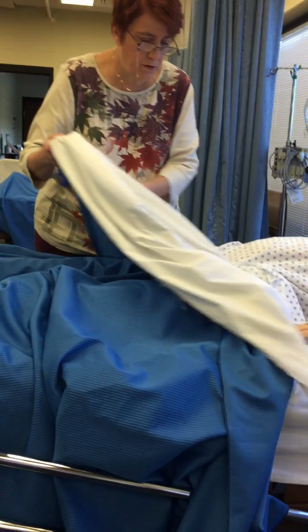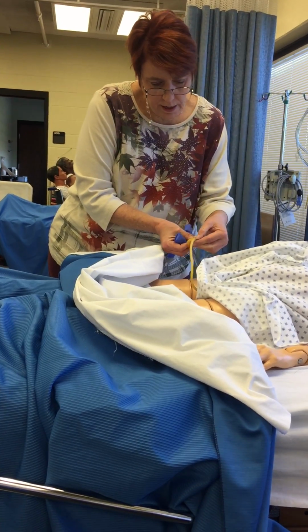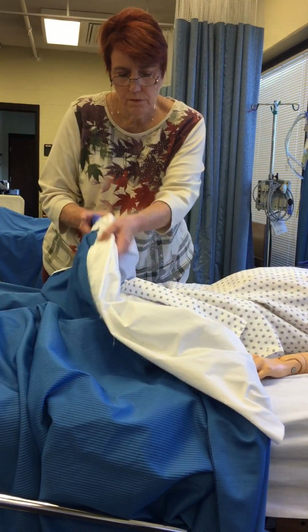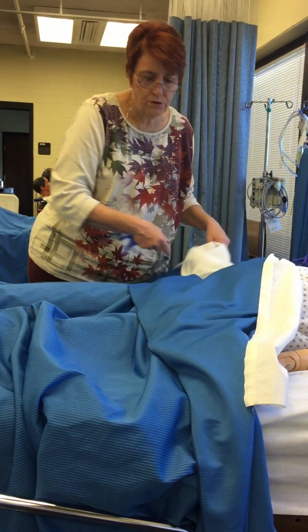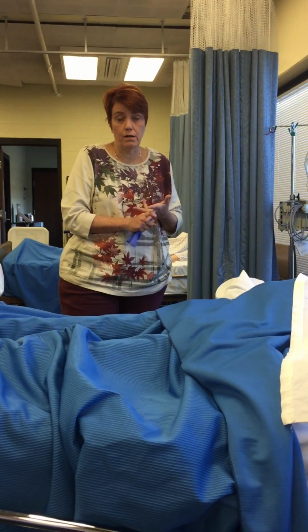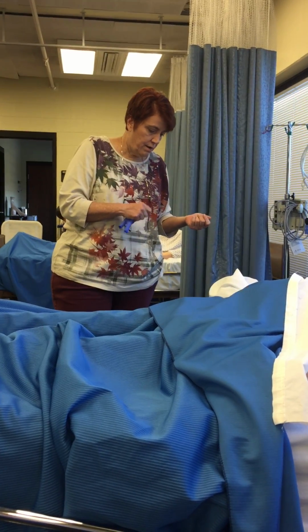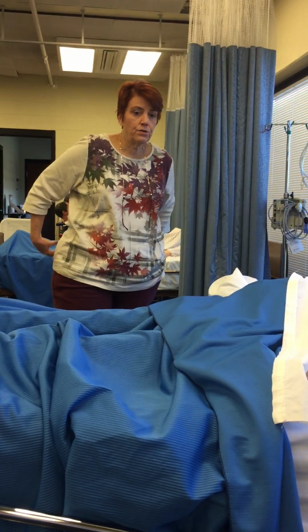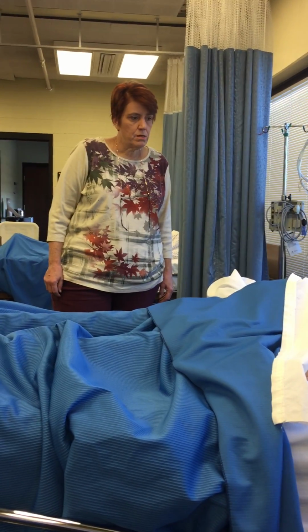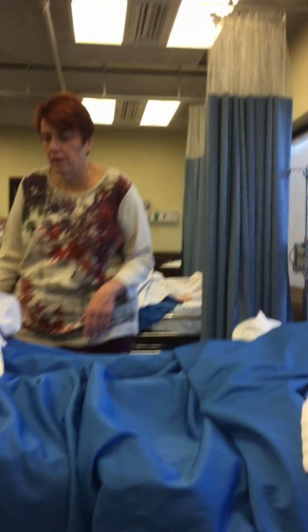Also, it's going to tell you on your tubing right here how much saline is used to inflate the balloon. You're going to document what kind of urine output you had, how much, what it looked like, what color, did it have anything floating in it, basically. And you're going to document how she tolerated it. And that's all I can think of. I'm sure I've forgotten something.